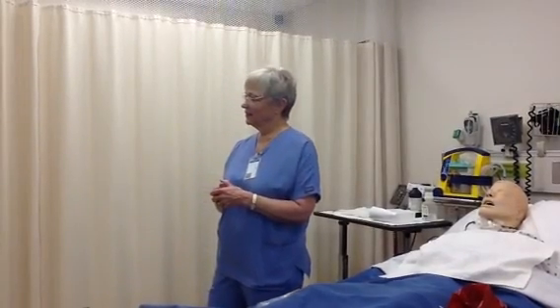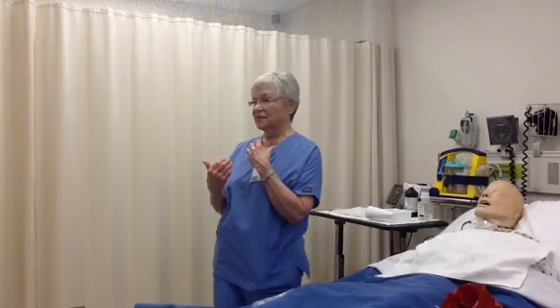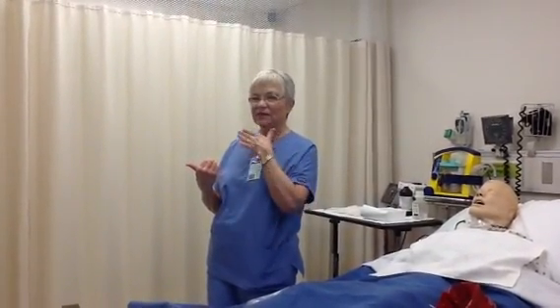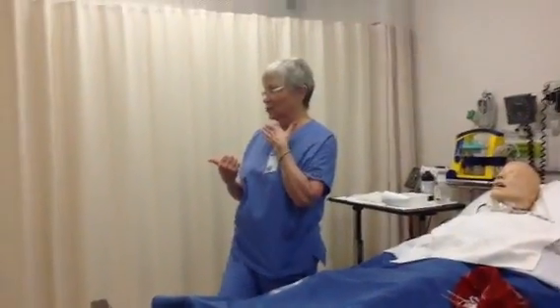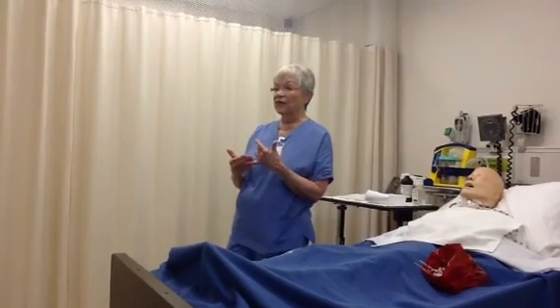Anything else? Are there different types of trachs, and would that make a difference as to how often you would change the inner cannula? Possibly. Actually, some people that have a tracheostomy have no appliance there at all. It's just healed. Many times those people will have something just to place over that for aesthetic reasons. There are trachs that have disposable inner cannulas. There are trachs that do not have an inner cannula at all that still need to be cleaned. The principles for any of those will be the same as what we've demonstrated here.